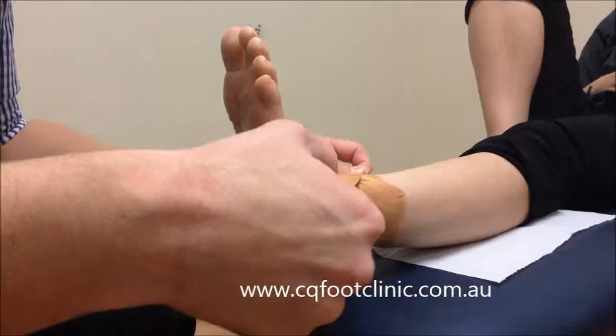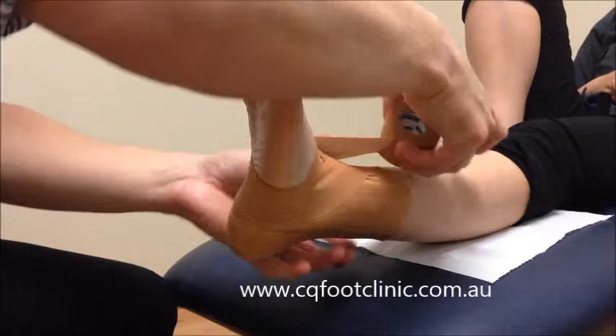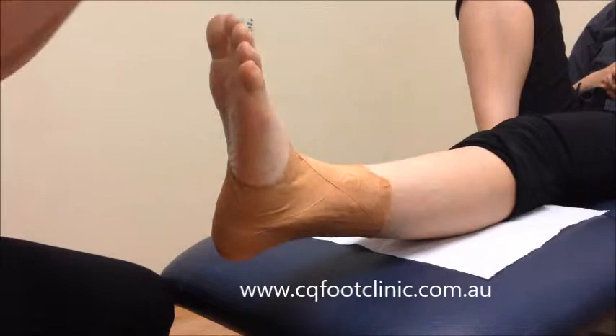Next we'll be doing eights, where we start on one side at the top, down and around, and back up onto the other side. We'll do two of those.